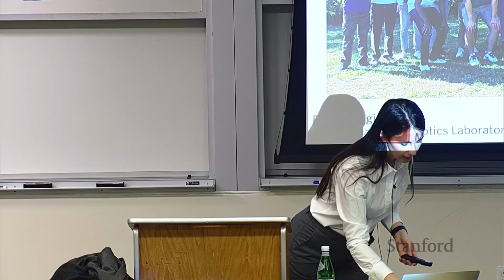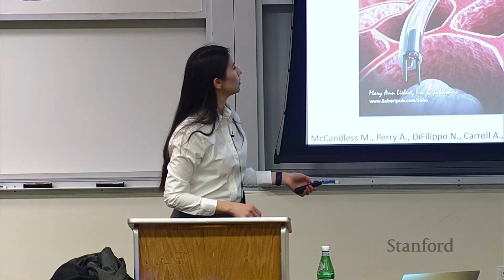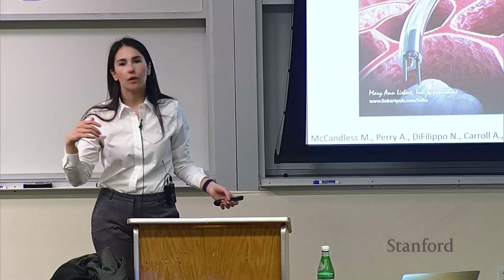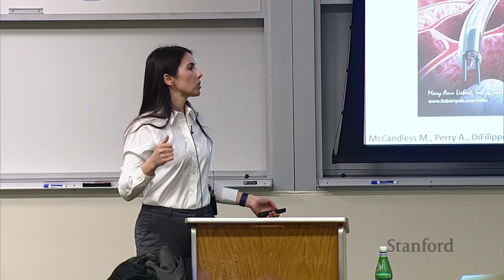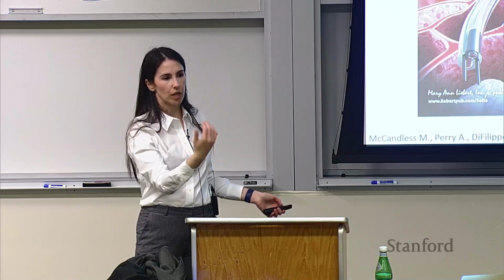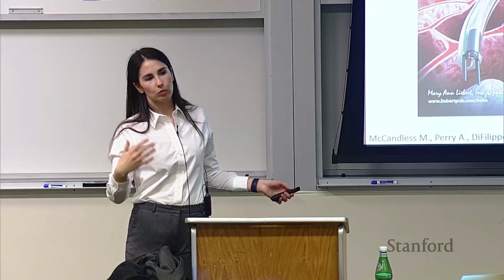Yeah, so currently in bronchoscopy, a system like, for example, this one that I'm showing over here, a traditional bronchoscope has 1 degree of freedom. For traditional endoscopes in general, you typically have 1 degree of freedom, unless we're talking about colonoscopes that are slightly larger, where you can get 2 degrees of freedom, pitch and yaw. Typically, you only have 1 degree of freedom with traditional instruments. And so what you end up doing is the clinician rotates from the outside to achieve a full range of motion. With our robot, we obviously want to do better, we want to do more.